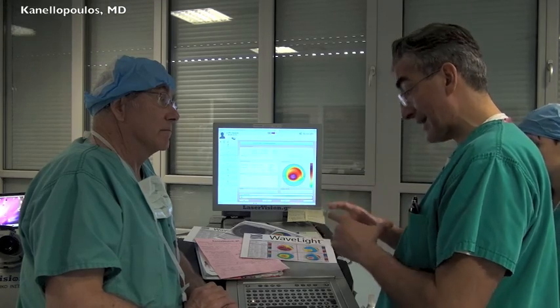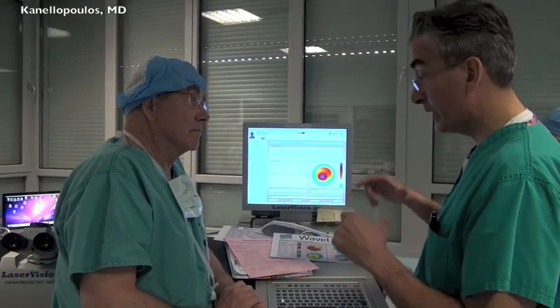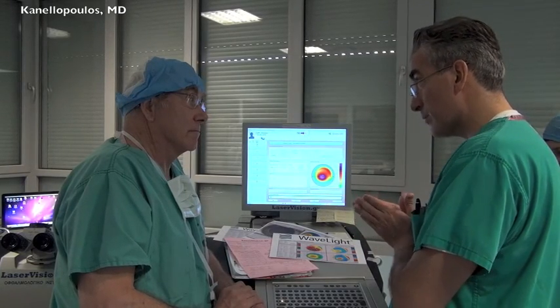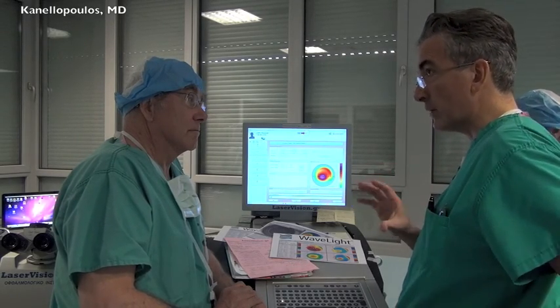So that means the rest of the PTK at 6.5 millimeters diameter, and we'll see the epithelial maps on this patient as well. We have them. It'll be going through Bowman's, where in the center, the cone will appear around 75% down the PTK. And the epithelium over the cone is around 38 to 40 microns thickness.